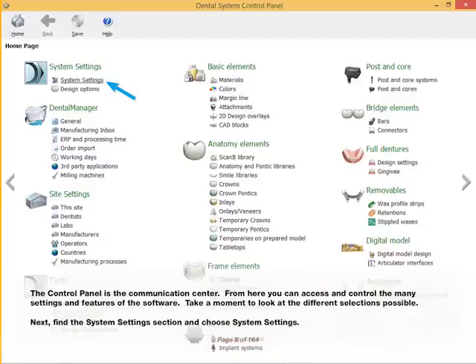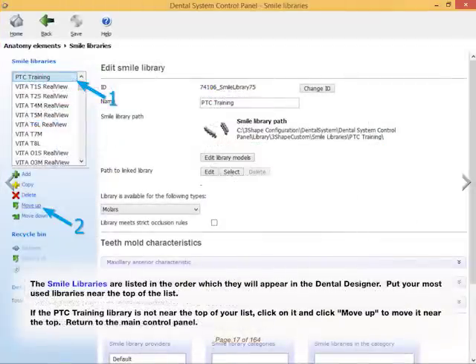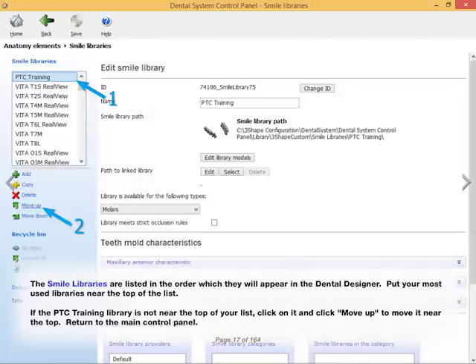Take a moment to look at the different selections possible. Next, find the System Settings section and choose System Settings. The Smile libraries are listed in the order which they will appear in the Dental Designer. Put your most used libraries near the top of the list. If the PTC Training Library is not near the top of your list, click on it and click Move Up to move it near the top.